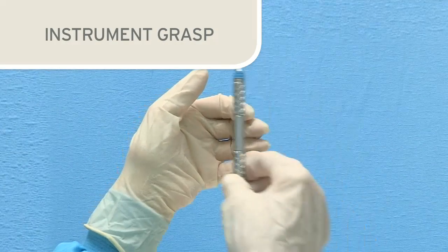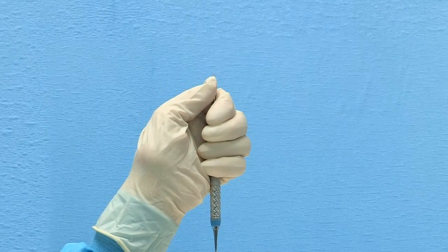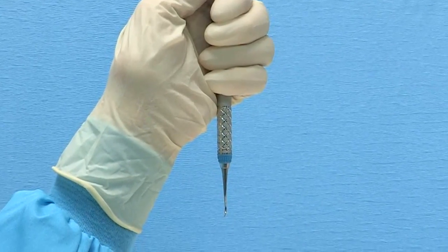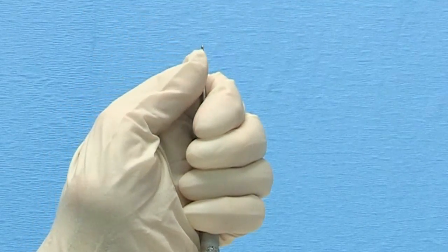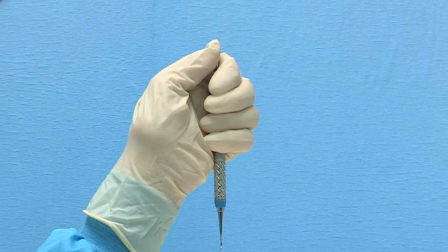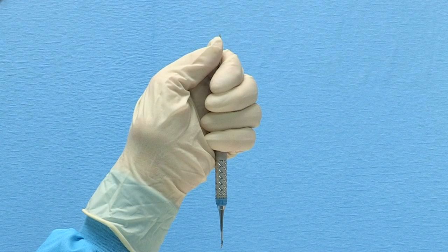Whether sharpening scalers or curettes, the instrument grasp will be identical. In your non-dominant hand, hold the instrument vertically with a secure palm grasp. The blade to be sharpened should be at the bottom with the toe pointed toward you. Rest your thumb on the upper shank. This is very important as it will help stabilize the instrument when pressure is applied on the blade during sharpening. Resting your elbow on the table will also aid in maintaining stability.